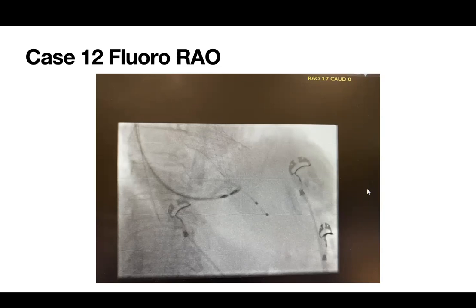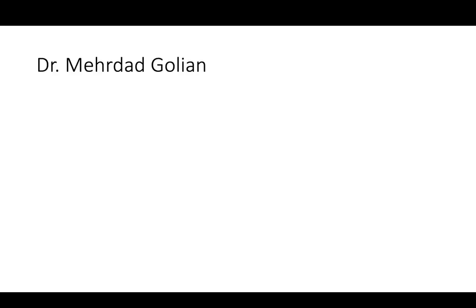So I think the combination of looking at V2, V1, and maybe a standard V1 is probably the place. One of them needs to have an R prime, or going to have an R prime, I guess, but it's not always the same for every patient, especially older patients with kyphosis and stuff like that. Or COPD. Yeah, so COPD, interesting, lower for heart, stuff like that. For Brugada, we go up. For this, we're going down.